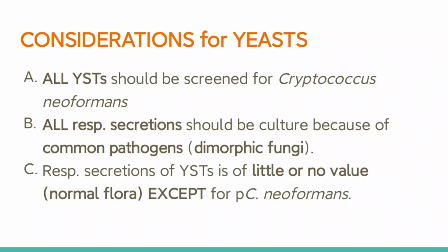Okay? Next, for letter B naman, all respiratory secretions should be cultured because of common pathogens. Ano ba yung mga common pathogens natin for respiratory secretions? We have the dimorphic fungi. So, sina Histoplasma capsulatum, Blastomyces. So, sulat natin, Histoplasma capsulatum, Blastomyces dermatitidis, si Coccidioides immitis, and lastly, si Sporothrix schenckii.